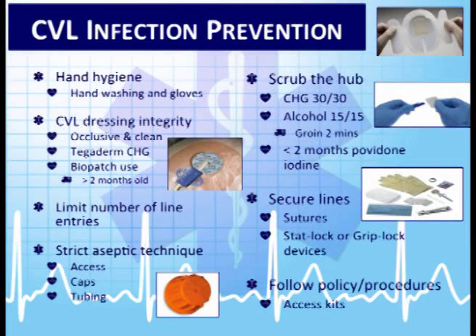The groin, the only time I would think that you would see a groin line in the femoral vein would be in the hospital, if you're doing an intrafacility transfer. Those are really, really high risk for central line infections. They try to not put them in the groin area. However, sometimes you don't have any options. People may not have good subclavian veins.